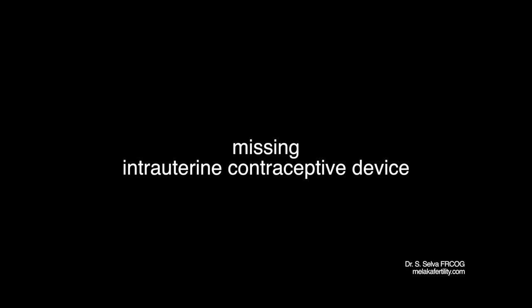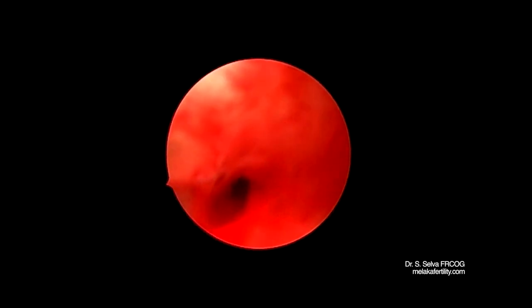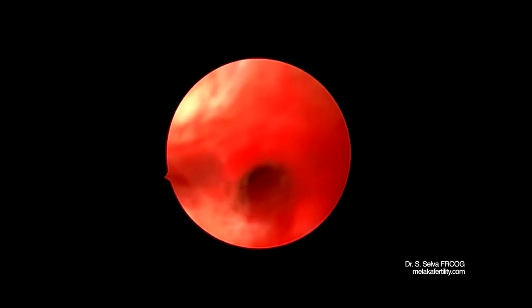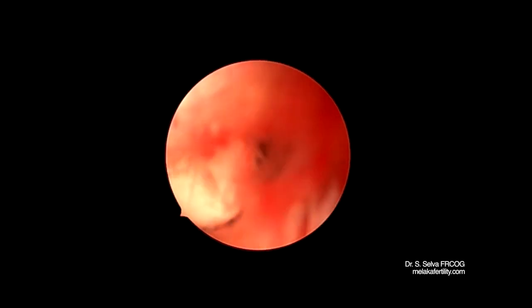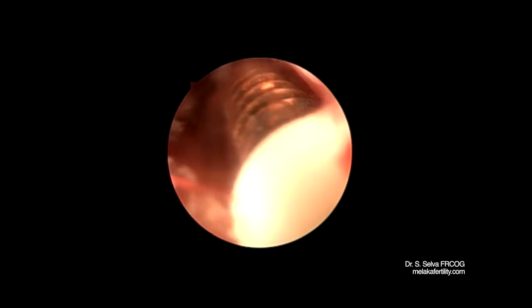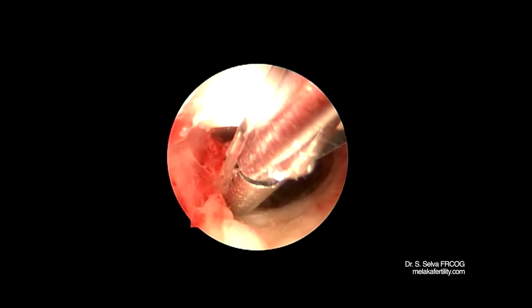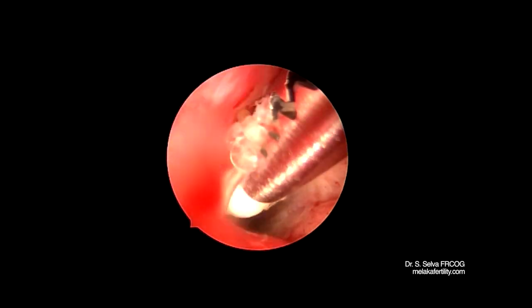Missing intrauterine contraceptive device. In this patient, the intrauterine contraceptive device thread was not seen. She underwent an office hysteroscopy. There was some difficulty negotiating the internal os. The tip of the intrauterine contraceptive device was seen at the internal os, and then seen in the uterine cavity. The thread was held and the IUCD was removed.